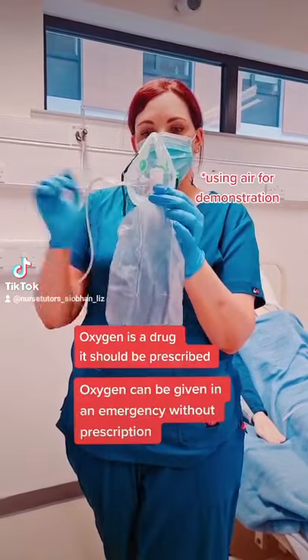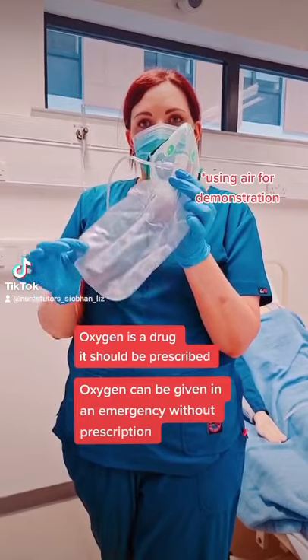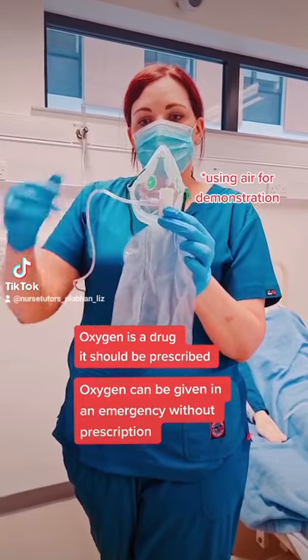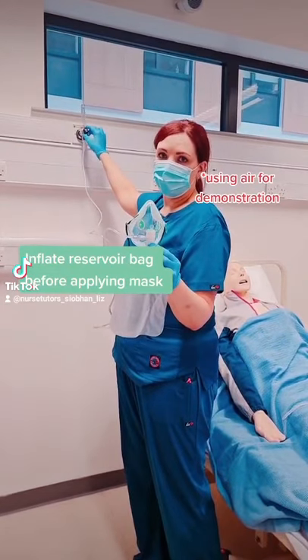This is a non-rebreather oxygen mask with a reservoir bag. It's connected with oxygen tubing — we have it connected to air for the purpose of demonstration.